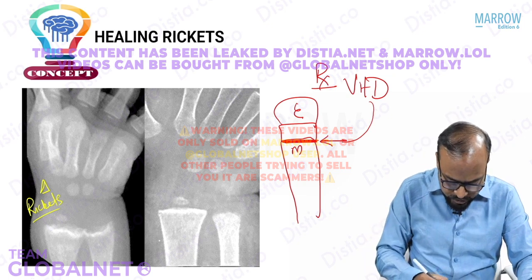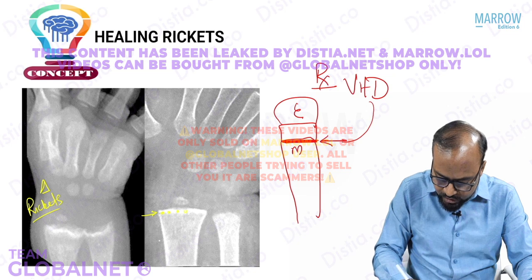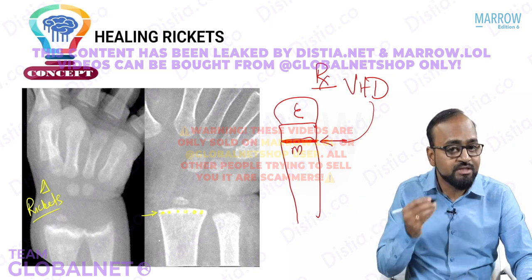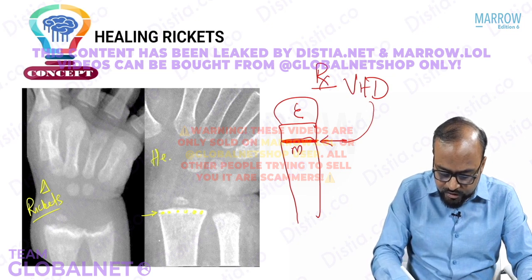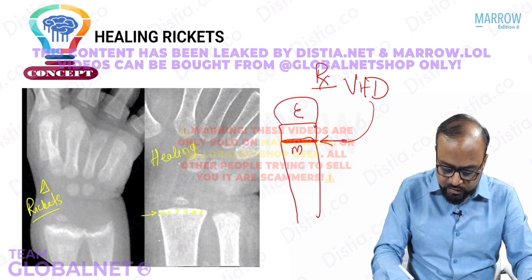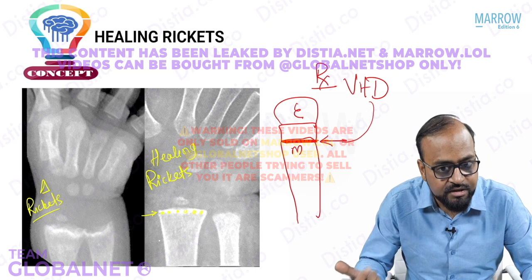So if you see in this particular image here, see this white line that you see here at the metaphyseal margin, this tells you that the child is responding to treatment, and therefore this is a case of healing rickets. That is how the radiographic sign of healing rickets looks.